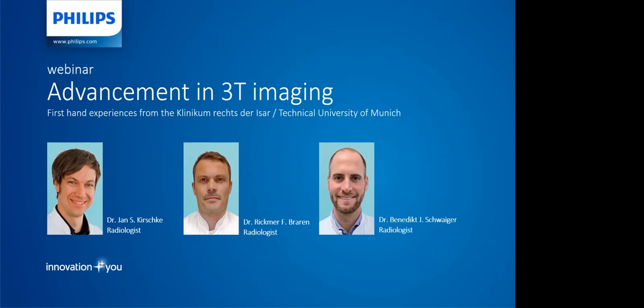Yeah, one more comment. With 2D images, the only difference probably is that the acceleration that we gain is about 50% in 3D imaging and about 20 to 30% in 2D imaging.